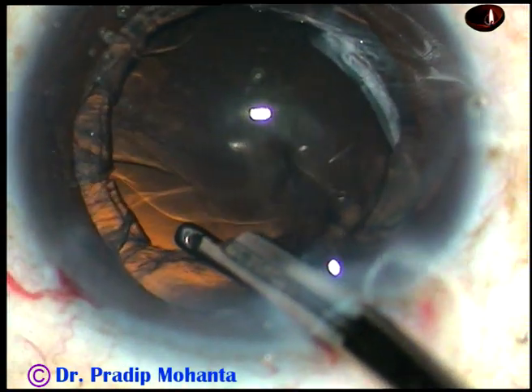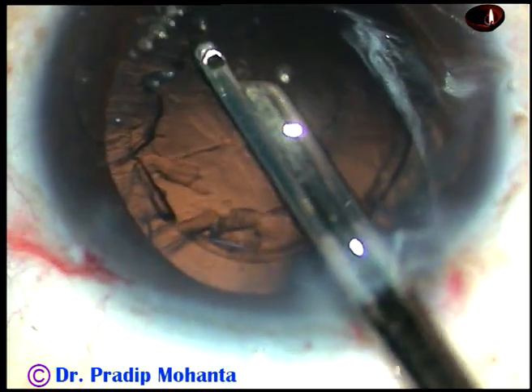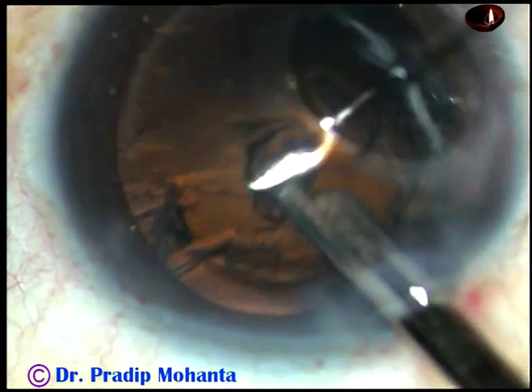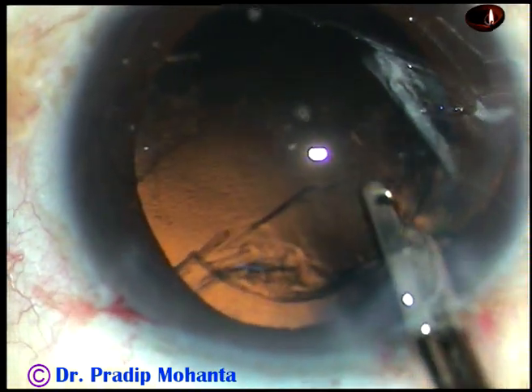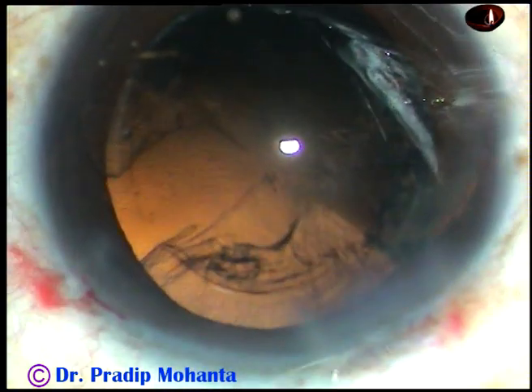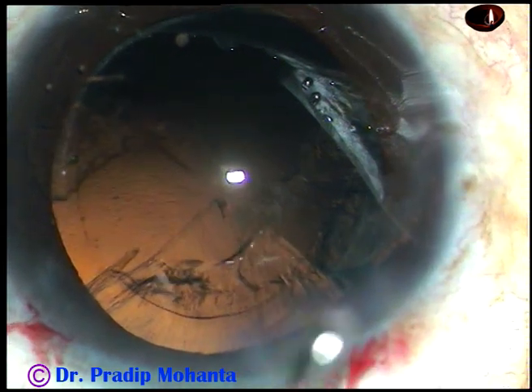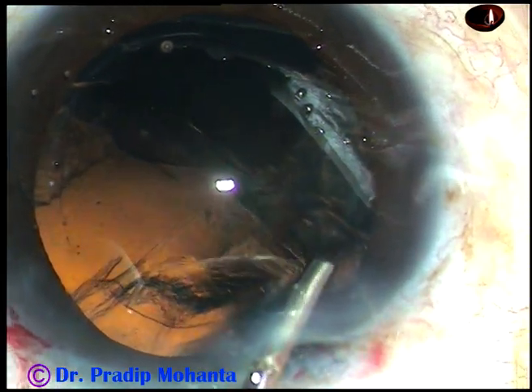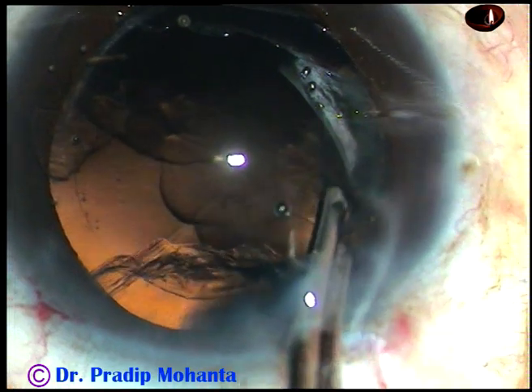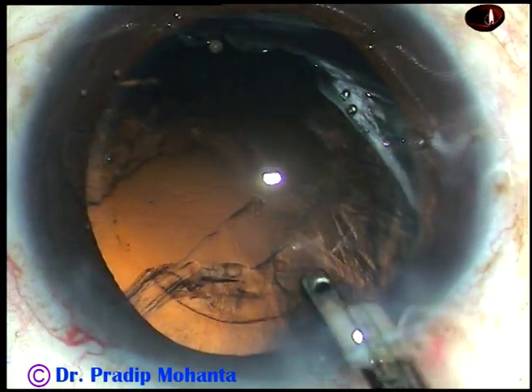And now, cortical cleanup. Since I have made only one side port, I am not going to use bi-manual irrigation aspiration. The Simcoe is a beautiful instrument to remove the cortical matter. The side port is a little larger, but you need only one side port. It is 3 o'clock hours away, and the astigmatism induced by the main incision is partially corrected by the side port if it is made 3 o'clock hours away.